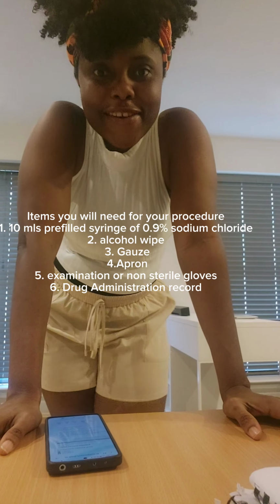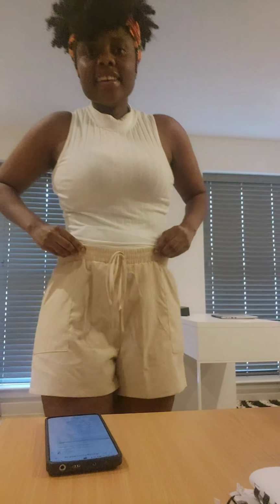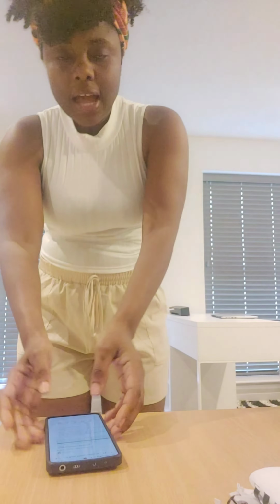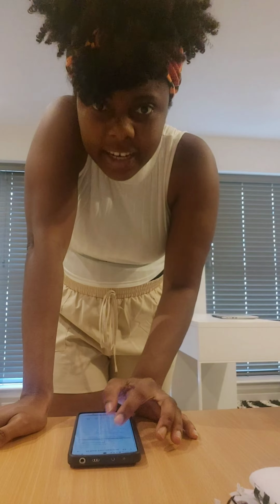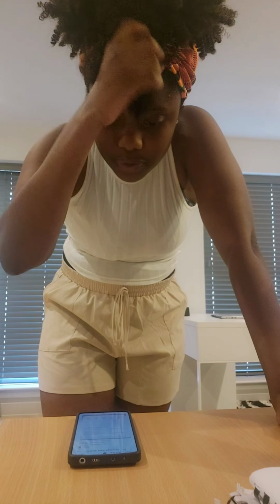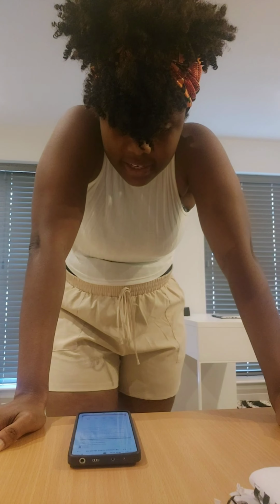Okay, so today we are going to do visual infusion phlebitis, that's VIP, and intravenous cannula flush. I'm going to read a scenario, which is what we are going to use to perform this procedure. You are the nurse in the medical unit. Please conduct a visual infusion phlebitis assessment and an intravenous cannula flush following the prescription chart below. You need to complete the documentation of administered medication in a safe and professional manner.